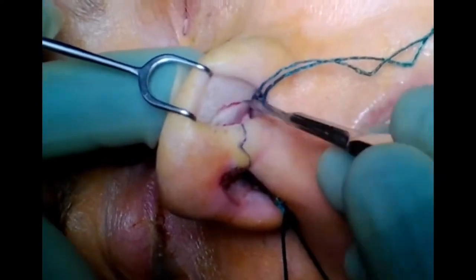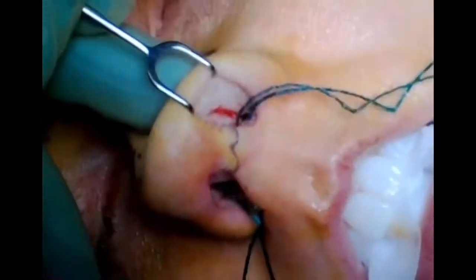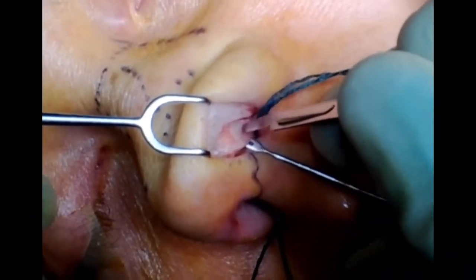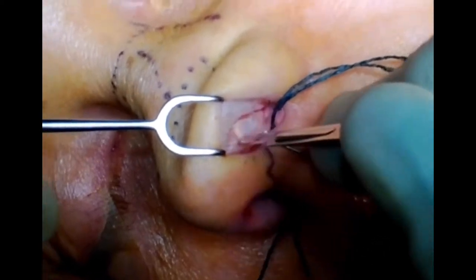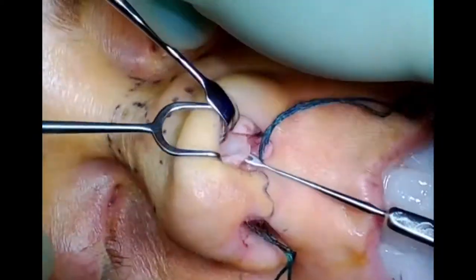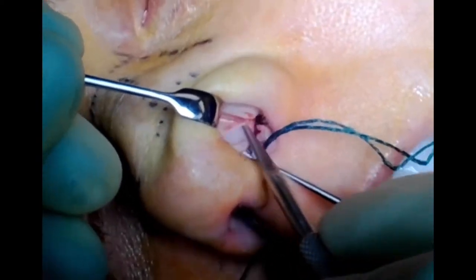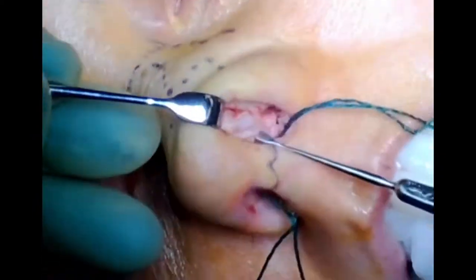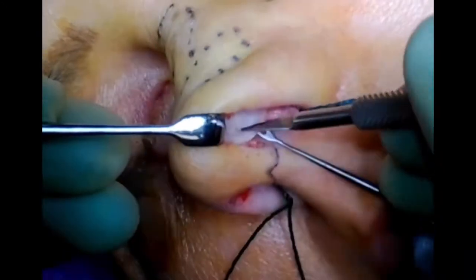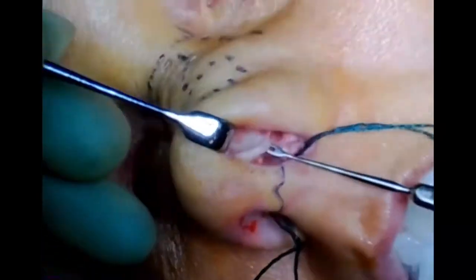We'll get started with marginal incisions. This is made with a 15 blade. We carry this just through the vestibular skin. Once we're through the vestibular skin, I'll have my assistant retract the vestibular skin down. Here I am using sharp dissection to develop the plane. The correct plane in this area is subperichondrial. You actually want to keep dissecting until you're certain you're in the correct plane. It can be a little misleading at first, but there is actually a tough fibrous layer on the cartilage and that's the perichondrium. Once you're under that plane, it actually comes up fairly easily. Here you can see I'm finding the correct plane in the dome area. Once you've got it, you can see that it's a pretty easy plane — it just sweeps very easily.